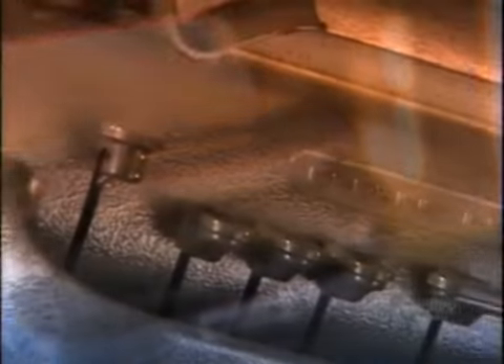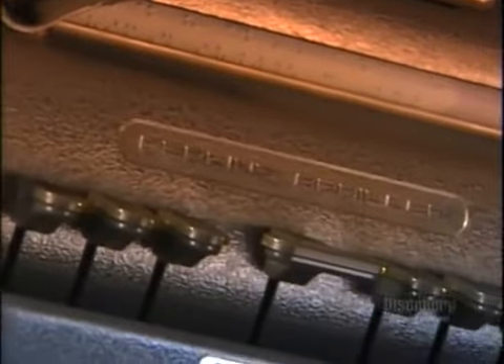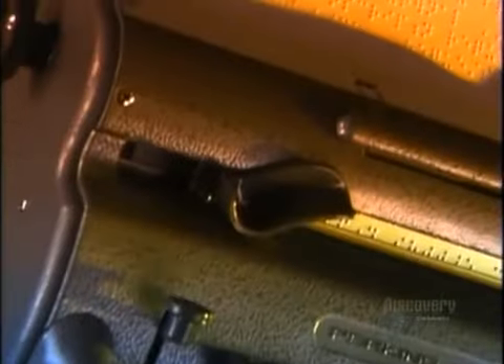A Braille typewriter types raised dots using the Braille system. It's based on six dots arranged in a rectangle, three dots high by two dots across. This is called the Braille cell. Different configurations of dots within this cell represent different letters of the alphabet, numbers, and punctuation marks.